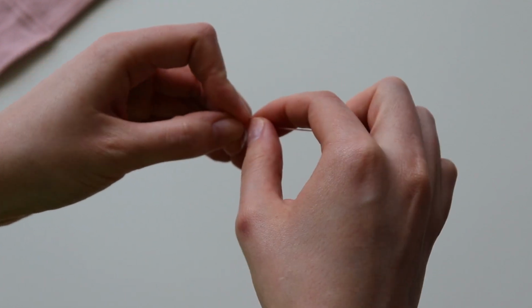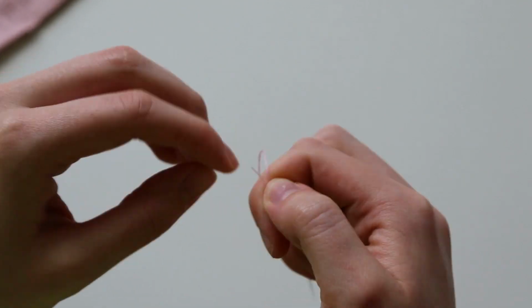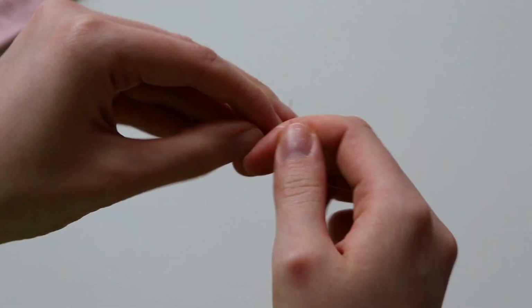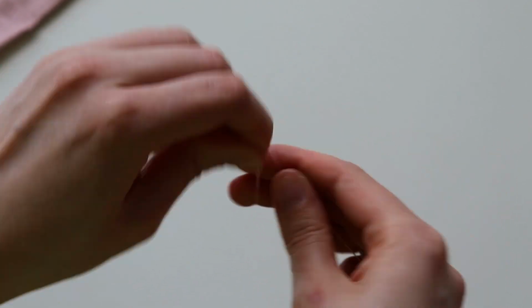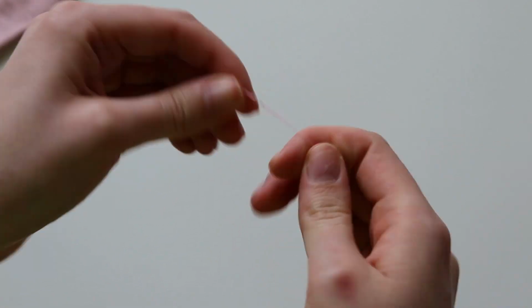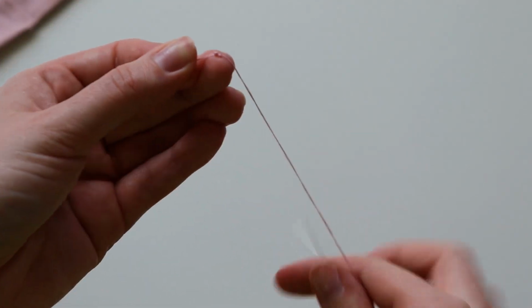And you all know how to tie a basic knot, I hope, and just making a really small little knot there. Now you're just gonna repeat this knot about 3 to 4 times on top of itself. So every time you make a knot, you are leaving where the knot actually ends up lying on top of the initial one, so that you end up with one big knot at the end of your thread.